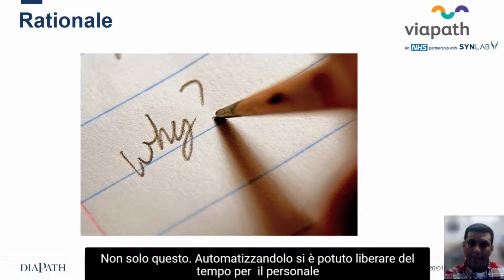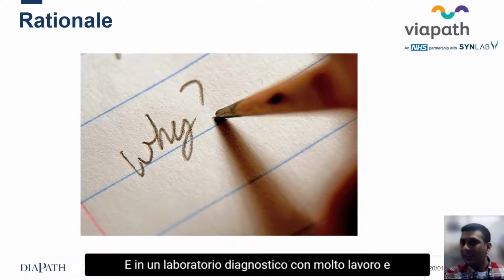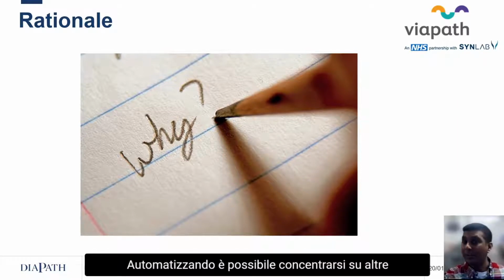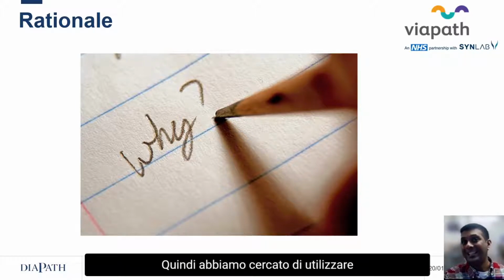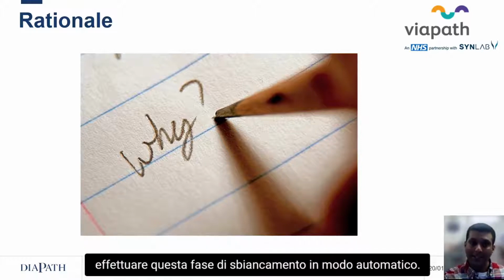Not just that, by automating it, it will free up staff time for staff to be able to do other things. And in a busy diagnostic lab where you're constantly bombarded with specimens and samples you want to deal with, you want to make sure you work in a very efficient manner. And so by making it automated, you can focus on other things while the machine does most of the work. So we tried to utilize an existing IHC platform to be able to perform this bleaching step in an automated manner.